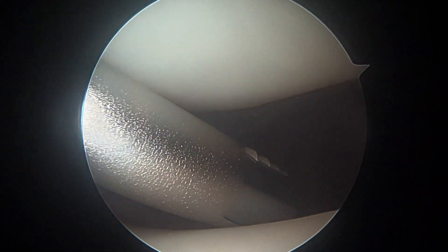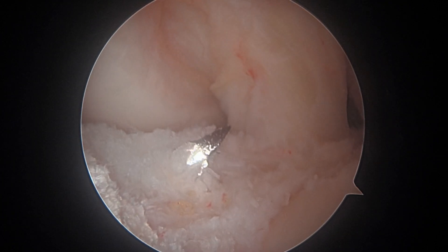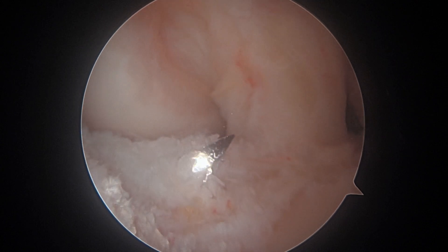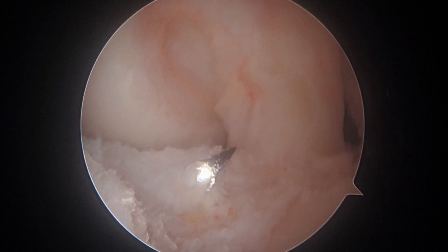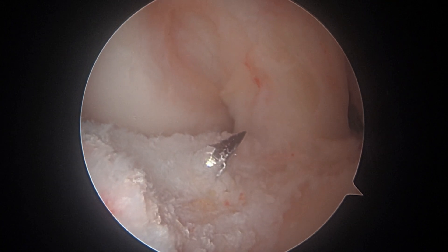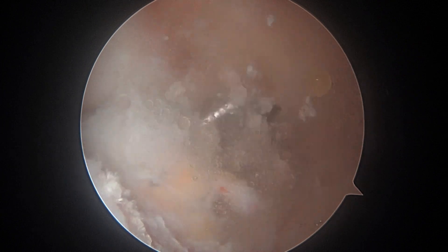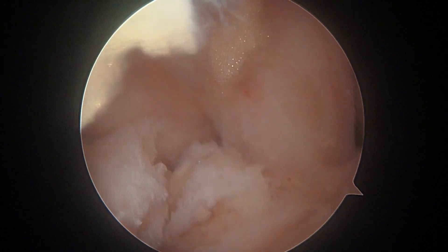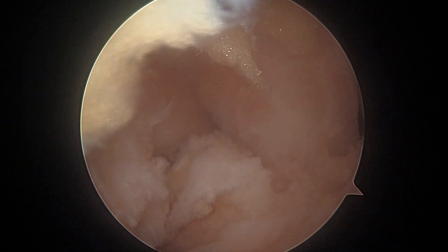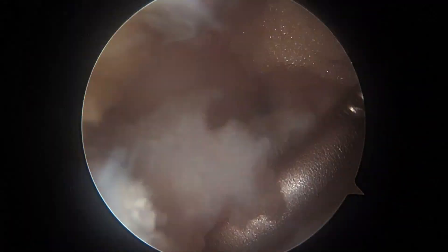So I think we're ready to start measuring things and drilling some tunnels for the ACL. We've got a guide wire in there, and we're just making a tunnel in the tibia — this is going to be an 8-millimeter tunnel based on the size of the graft. Okay, there it is right there. Now we'll back that out, and we'll take our shaver to clean up the edges of the tunnel right here. I'll show you some more in a little bit — let me just turn off the camera.